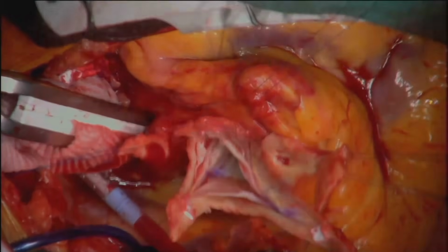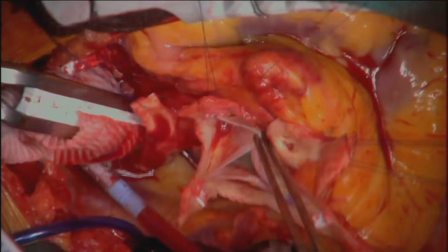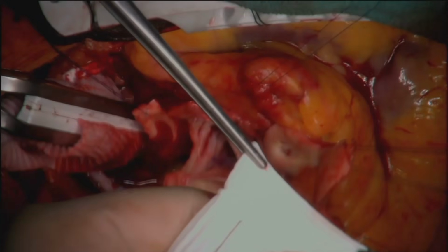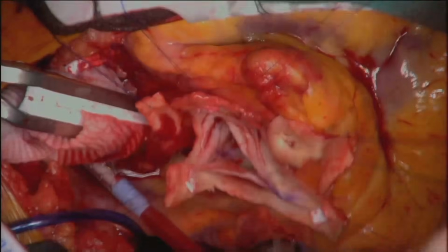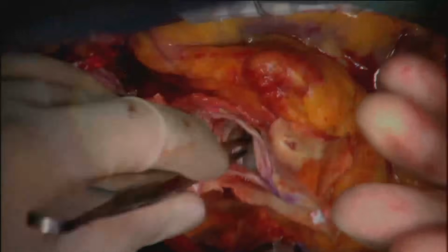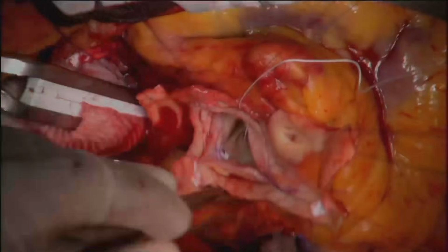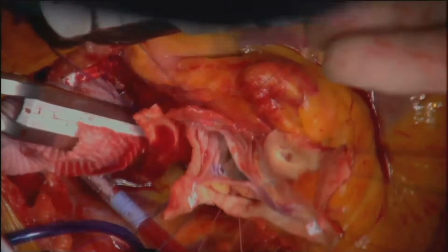The aortic sinuses were trimmed appropriately, leaving a decent cuff along the commissures and down into the sinuses to allow suturing of the graft. Plegeted 2-0 sutures were now placed from within the aorta underneath the valve and brought outside, taking care to maintain them in the same plane and avoiding the placement of sutures in the region of the membranous septum.